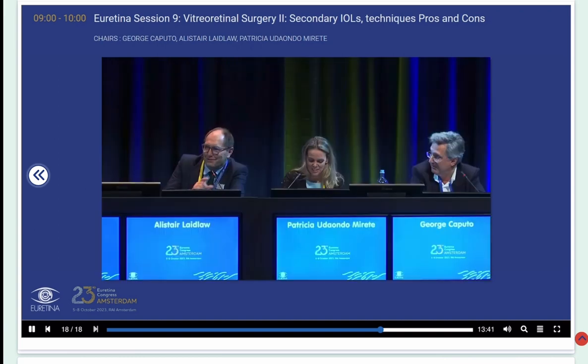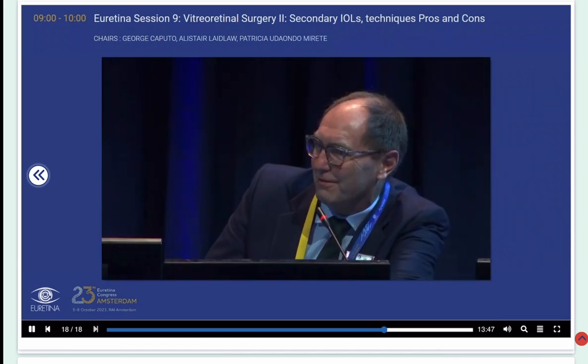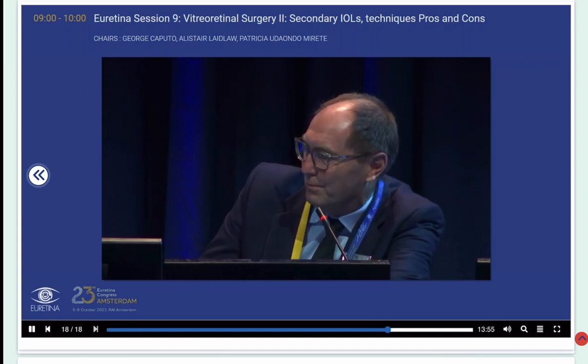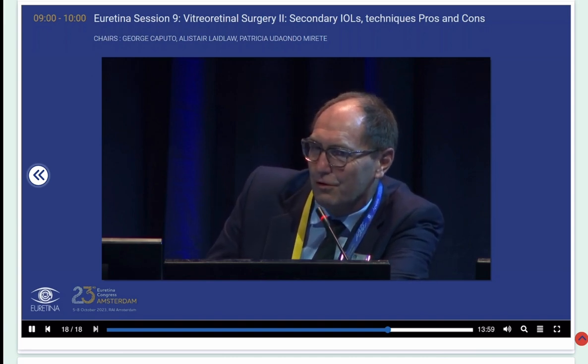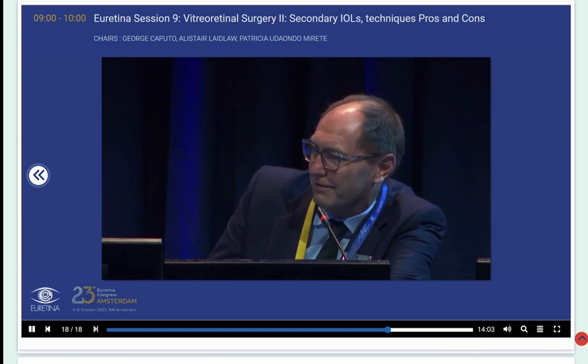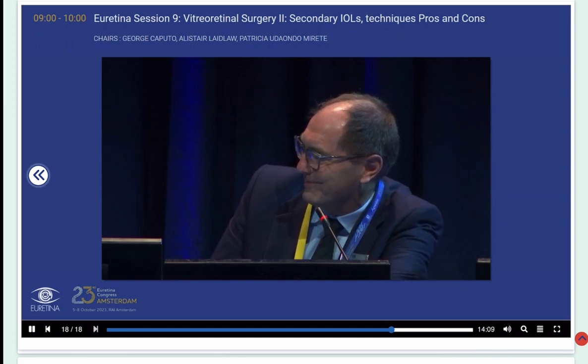Yeah, that's a lot of unhappy patients. Igor, we're making comparatively big holes in the cornea of eyes that have often had previous surgery, complicated phacos, they've had previous tunnels. Any sort of little top tips on how we should avoid astigmatism? Because this and cystoid macular edema, for me, are the guilty secrets about secondary lens implantation.